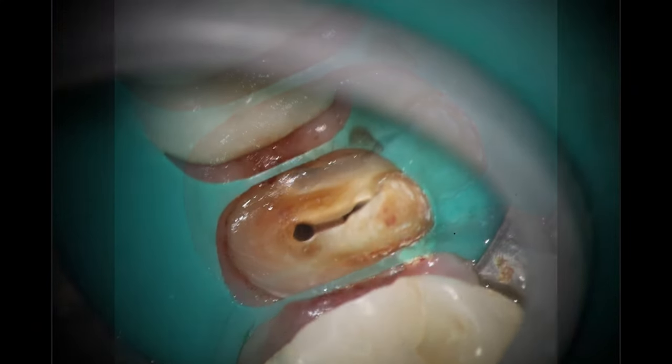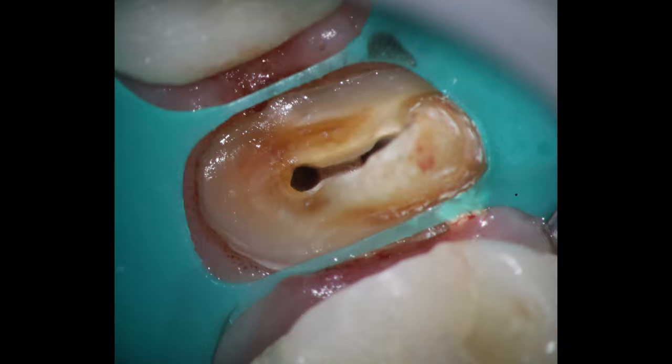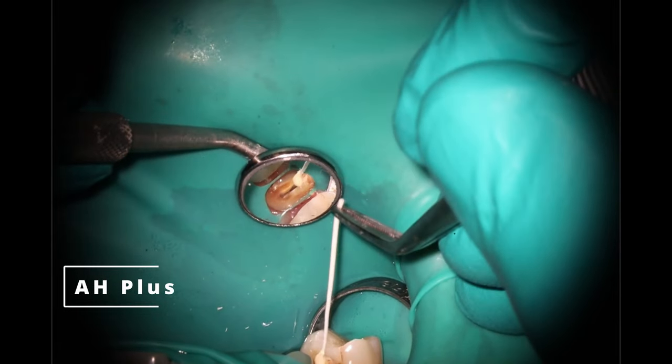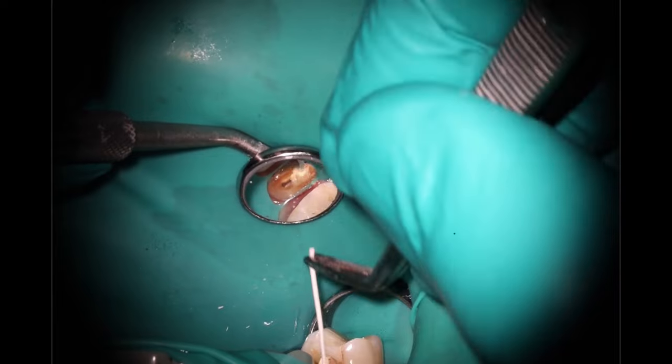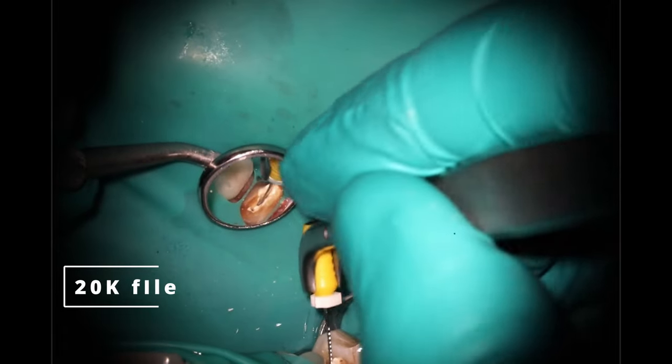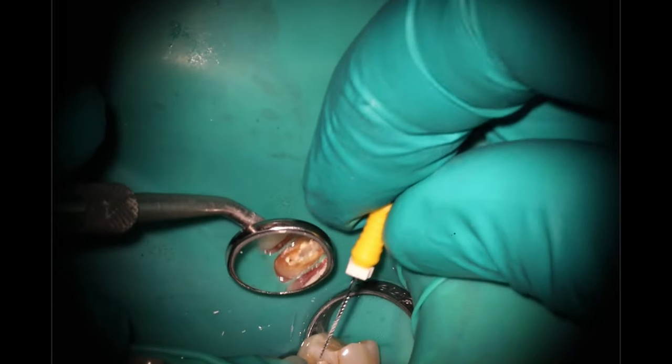I don't really have the assistant blow air into the chamber with theirs because it's a lot more powerful — no one wants embolisms. Going back in with our GP; it looks nice and clean inside. Going to do the squirt technique for this one. You want to go back in with a 20K file, just recapitulate to length, especially in a case like this where it's been tight and I've had trouble getting patent. It's really important to recapitulate, make sure you're patent and everything is clean all the way to the bottom.